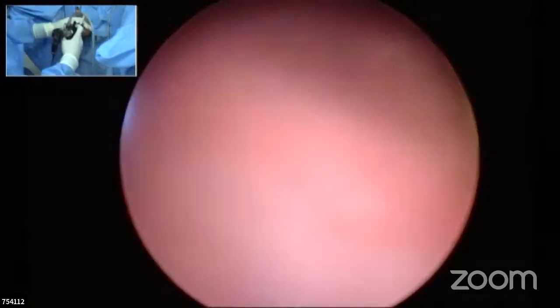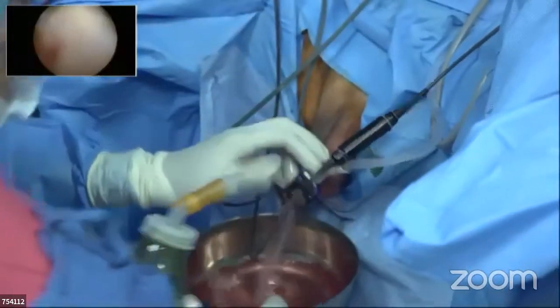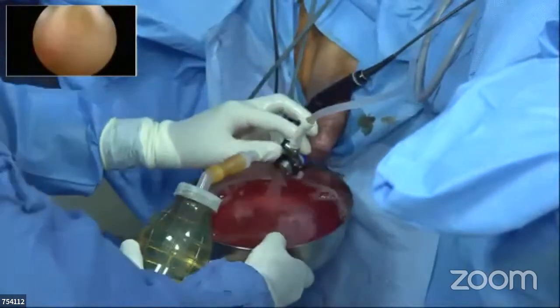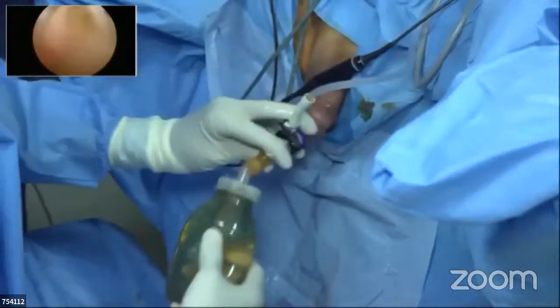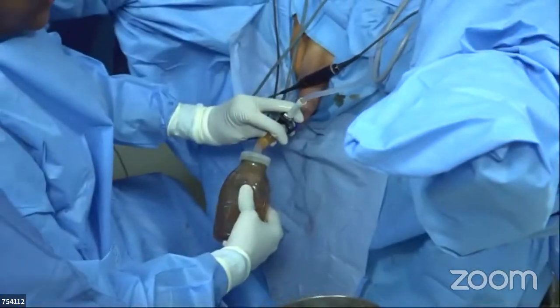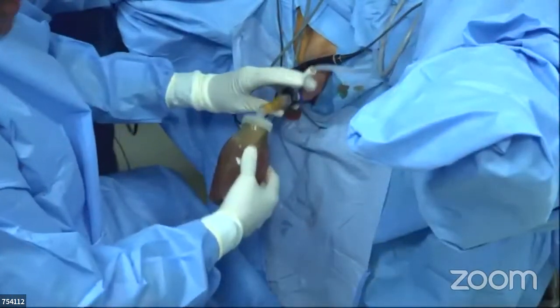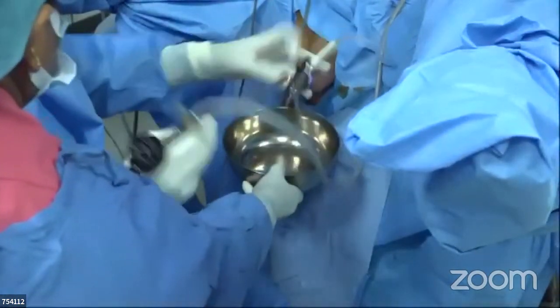At this point, Malik, would you like to change to a button electrode and do final vaporization of small bits of tissues which are around? No, sir. It is too much of a magnification. This is already a 4K cam with too much of a magnification on it. I don't think I need to do it, and I don't think I'll do it now. But in case, sometimes if there is a lot of bleeding, some ooze, I'll definitely do that. But I use it more for coagulation than resection or vaporization of the tissue.